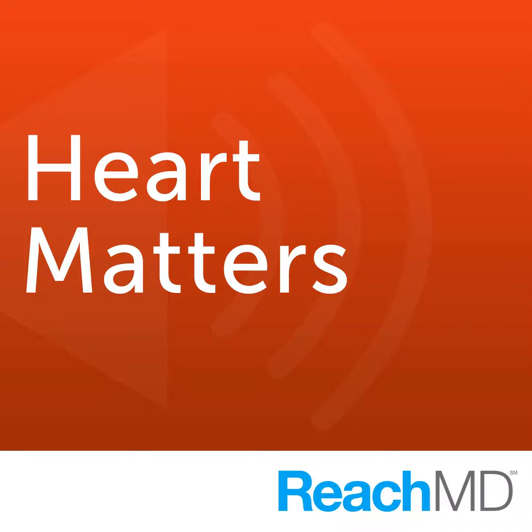Mark, you were telling us about a patient in the emergency room and how he or she might be evaluated. We might mention that CTA has a role in the so-called triple rule-out. That would be pulmonary embolus or dissection or acute infarct. Anything you'd like to say about the use of it in that way?